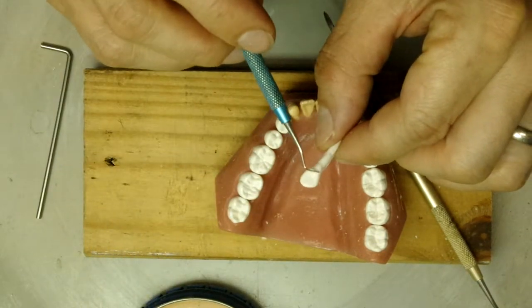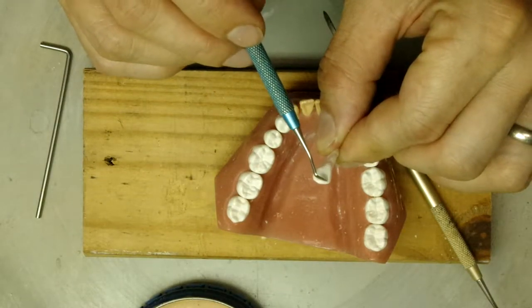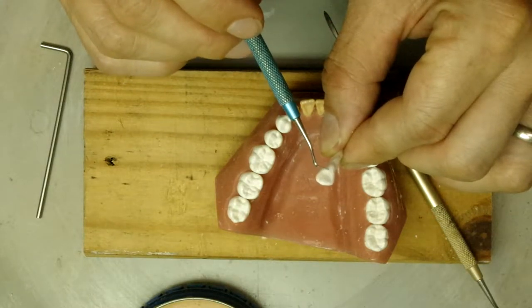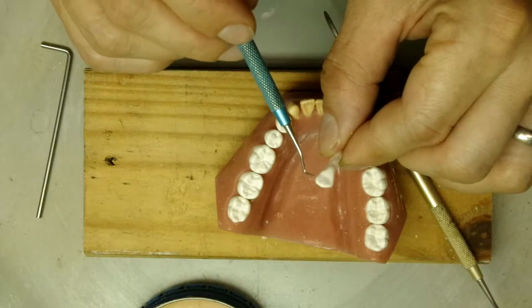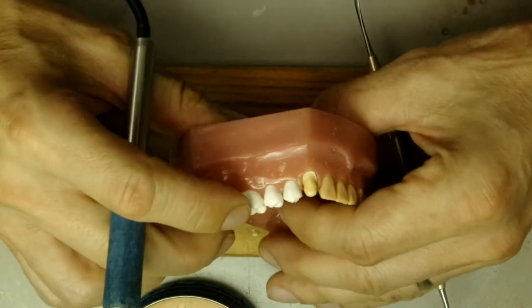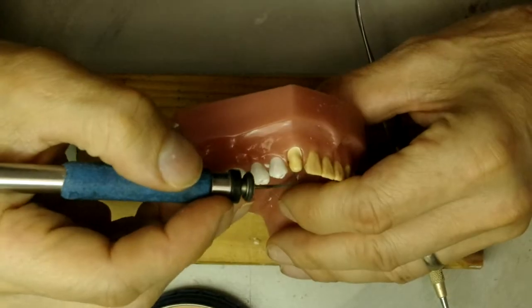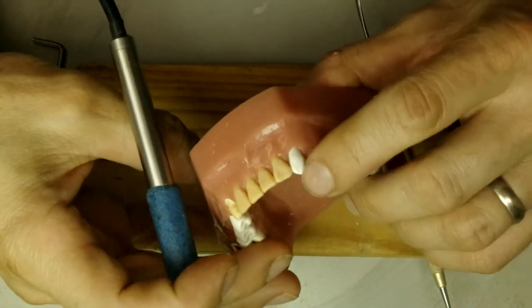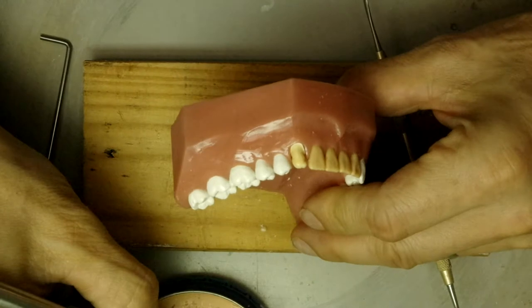If you look at the lingual, it's not quite as detailed as the maxillary canine. This has more or less a little bit of a concavity, and it doesn't have that large ridge that runs around on the maxillary canine. Okay, so with that, we'll start waxing. And it's basically the same startup, except here, we have the point angles kind of matching up with the laterals. So, we're gonna try to match those up.